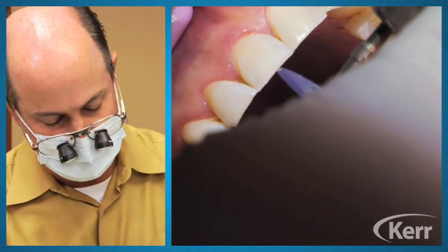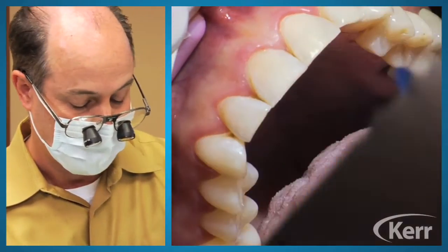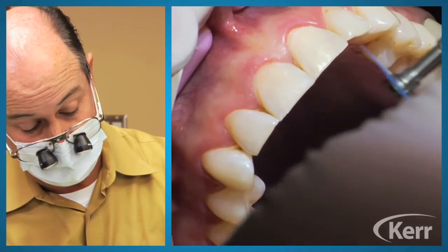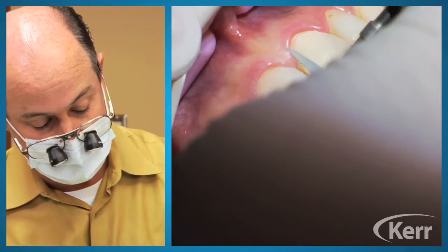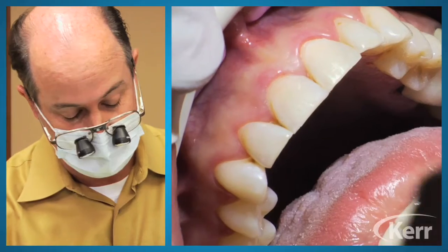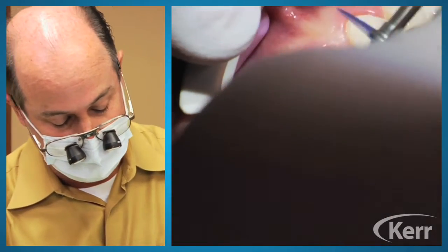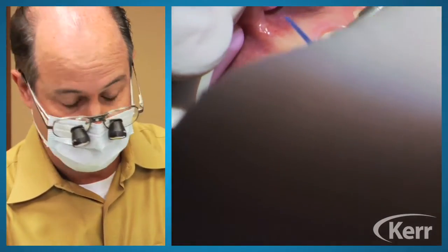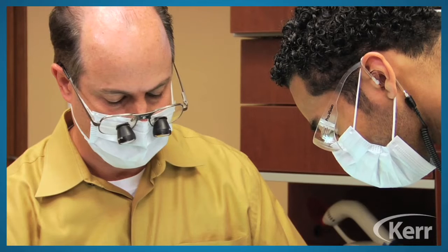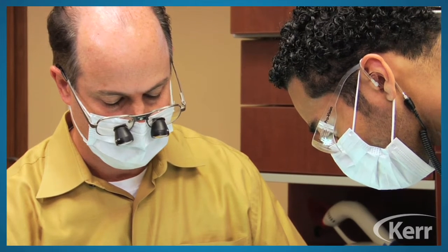Was to make this material something that handled well and was very nicely sculptable and didn't slump, and then also had nice polishability. Certainly the maintenance of the polish is something that we don't have any long-term studies on. That's the only kind of disadvantage maybe, but I think in my hands thus far, it showed a lot of very nice promise here. And you can see my assistant is putting a little extra water on it.